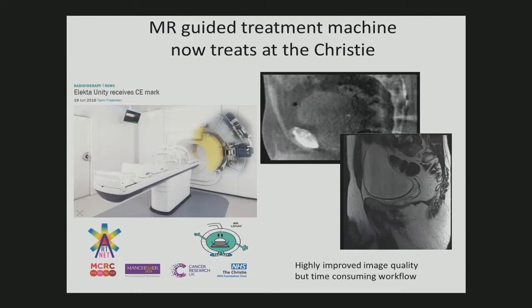things work together. So this is an MR coil, for magnetic resonance imaging. The coil is cooled with liquid helium, very super cool. So you have a superconductive magnet, and the magnet aligns the spins in the body, and you change that spin with radio waves, and you measure the resulting signal, and as a result, you can get a signal which is related to the chemical characteristics of the body rather than the density.